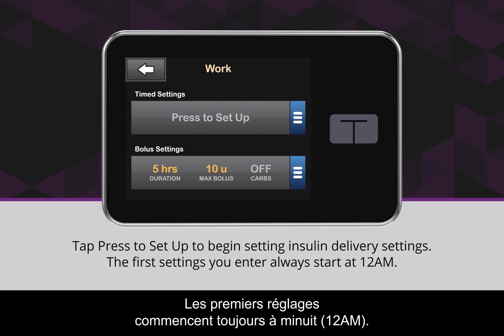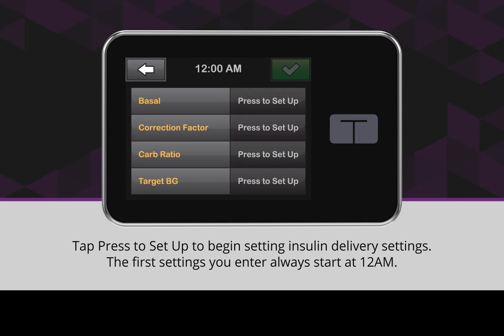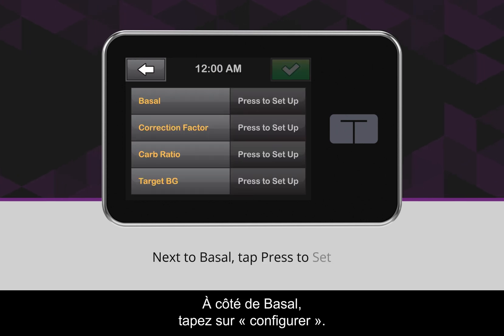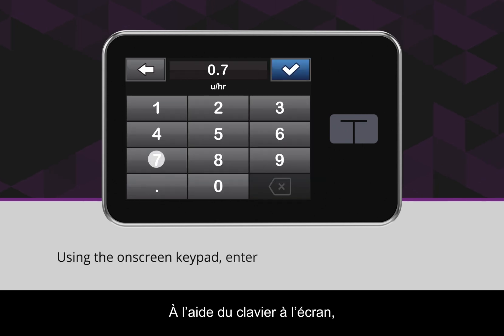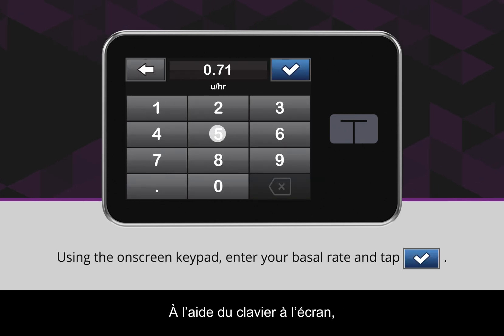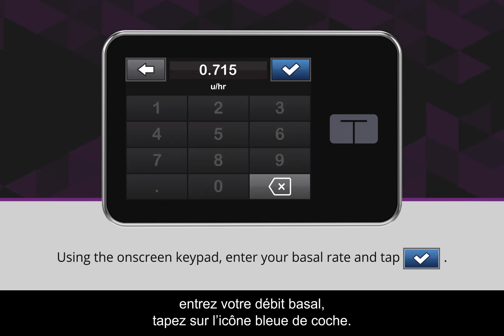The first settings you enter always start at 12 AM. Next to Basal, tap Press to Set Up. Using the on-screen keypad, enter your basal rate and tap the blue checkmark icon.